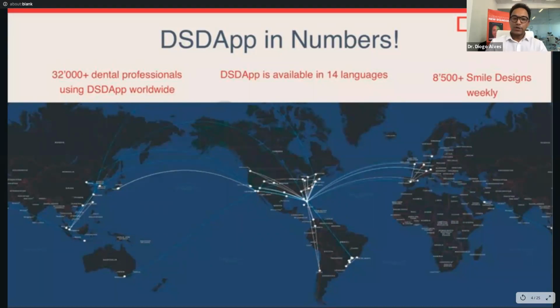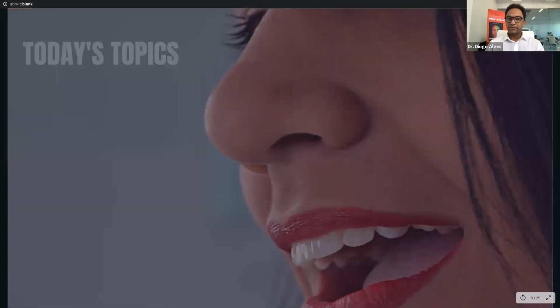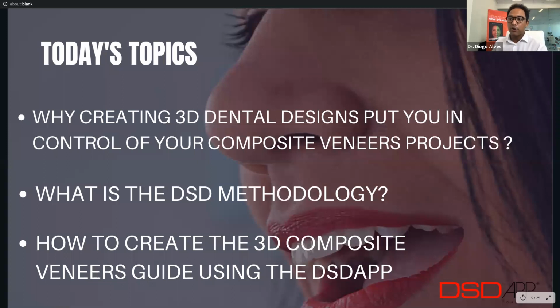So today's topic, we are going to be talking about why creating a 3D dental design puts you in control of your composite veneers course. What is the DSD methodology? And of course, how to create the 3D composite veneers guide using DSDApp.